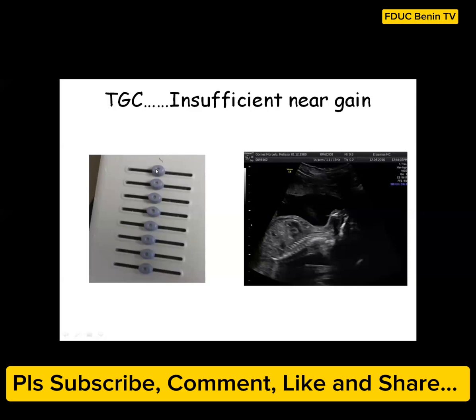This one represents the superficial area, and these other lower ones represent structures that are lower down. So if you move your slider this way, then this area will be so dark because you have reduced the gain.